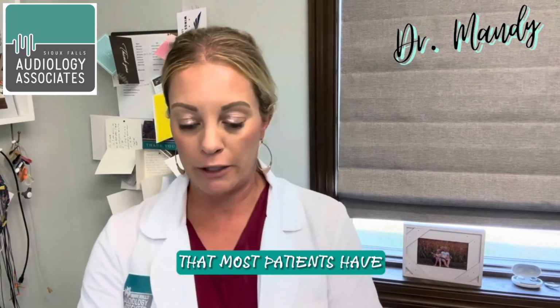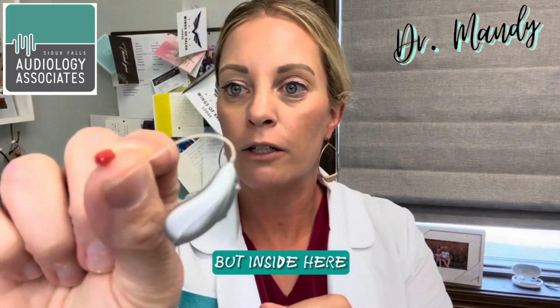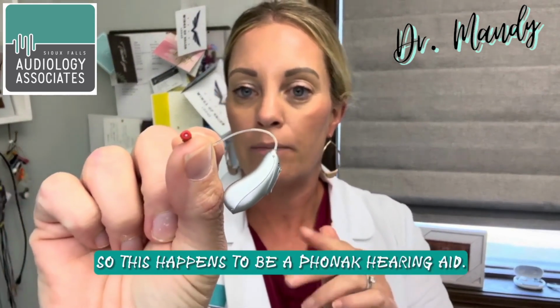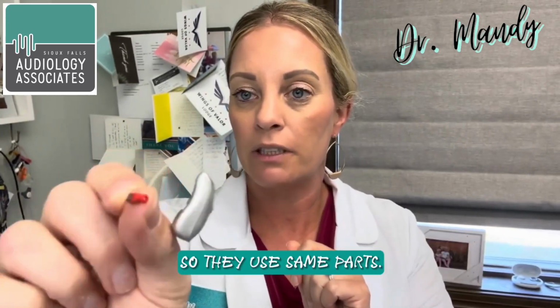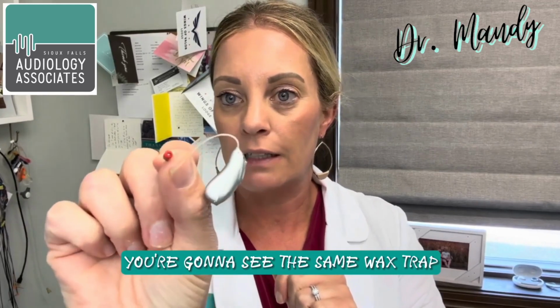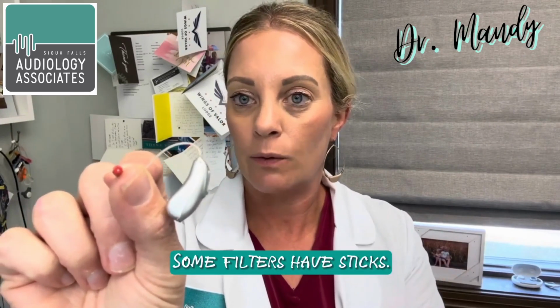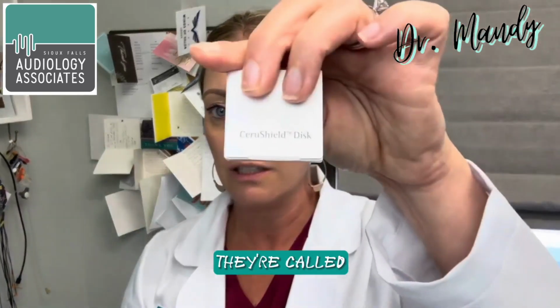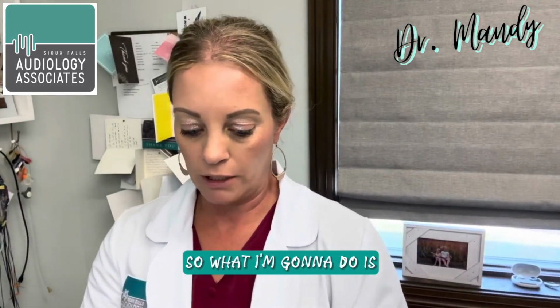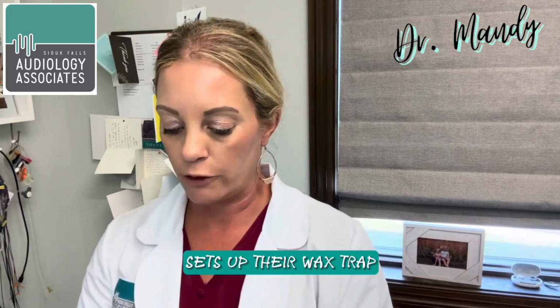The most common hearing aid that most patients have is an over-the-ear hearing aid. I pulled off the rubber piece, but inside here, you have a little white filter. So, this happens to be a Phonak hearing aid. Phonak and Unitron are manufactured in the same facility, so they use the same parts. So if you have a Unitron hearing aid, you're going to see the same wax trap, aka filter, setup. Some filters have sticks. This manufacturer and Unitron do not use sticks. They have these little disc type things called CeruShields. So what I'm going to do is take it out and show you how this particular manufacturer sets up their wax trap and how to use them.